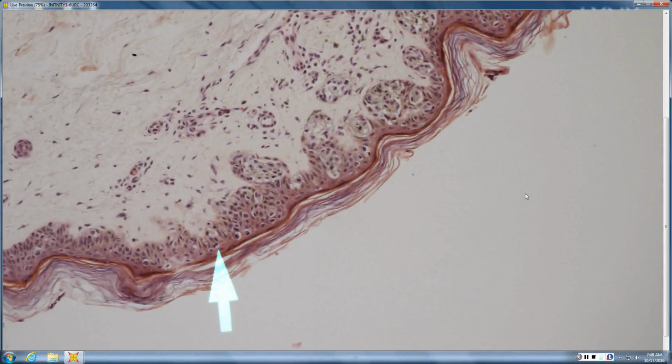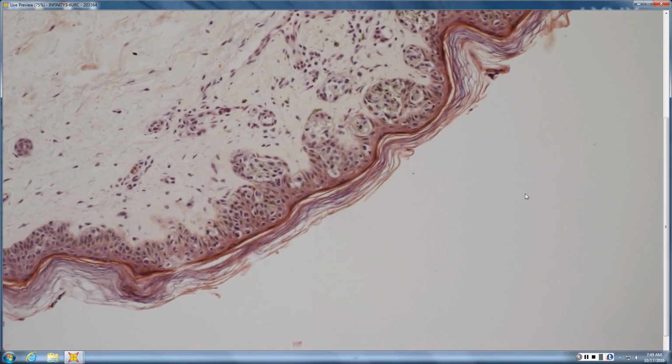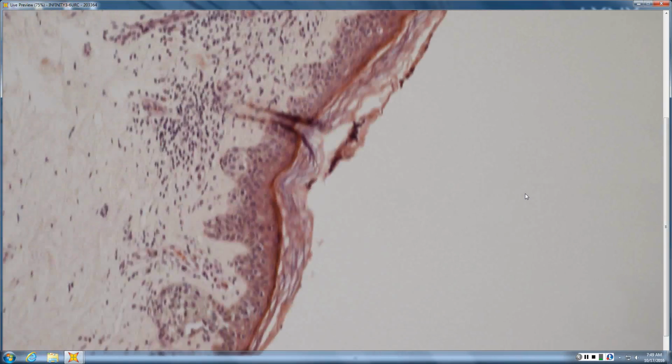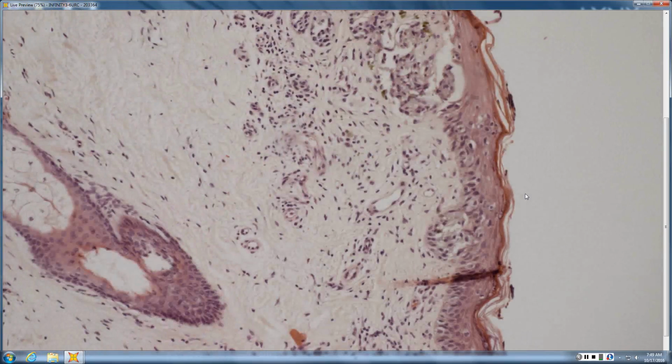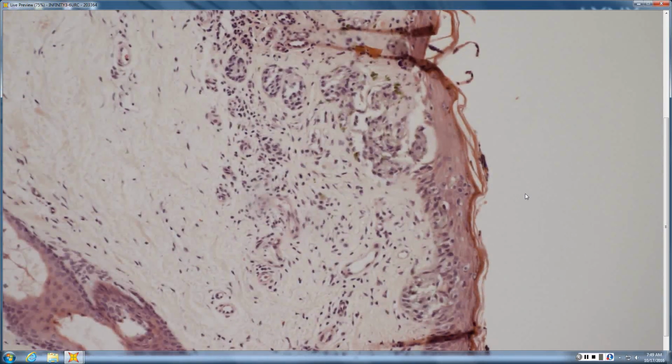So as you said, very broad. Areas where poorly nested melanocytes predominate over nests. Nests are not similar in size and shape. They are bizarre shapes, not round to oval, but very odd in shape. They are not equidistant from one another, not regularly spaced. There's consumption of the epidermis, effacement of the epithelium. It's on sun-damaged skin. Predominant pattern is at the DE junction, so lentigo maligna type of in situ with then a focus of invasive melanoma. Very good.